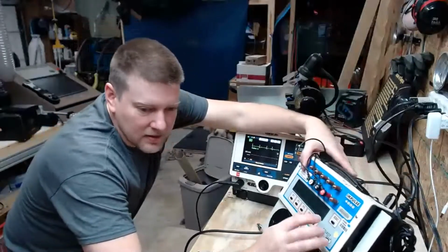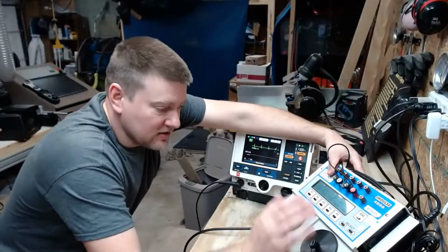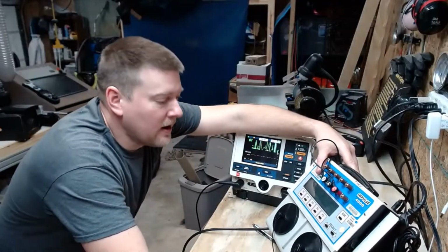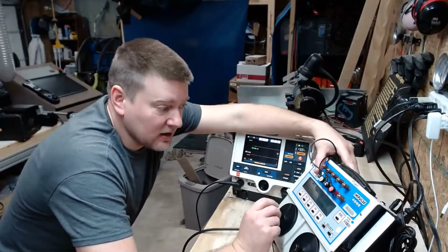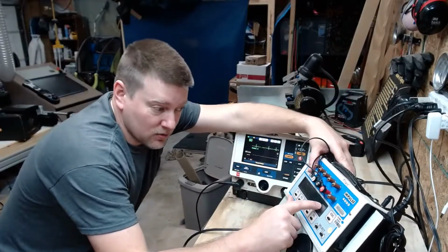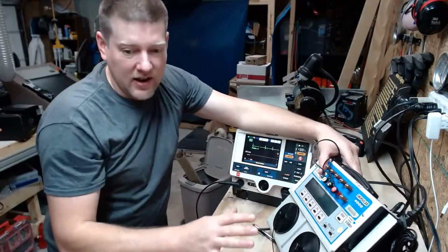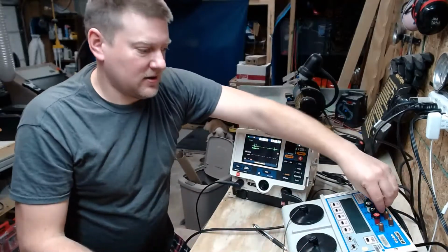The other important thing that my analyzer here tells me, up here in the corner, it says the amount of energy that it measured. So I told it to kick out 200 joules. Over here, it measures 205.6. So in my work order notes, I'm going to annotate that 200 joule cardio sync, I registered 205.6 joules at 24 milliseconds. And all defibrillator analyzers will have this cardio sync analyzer function.